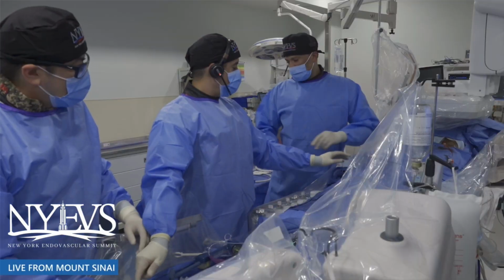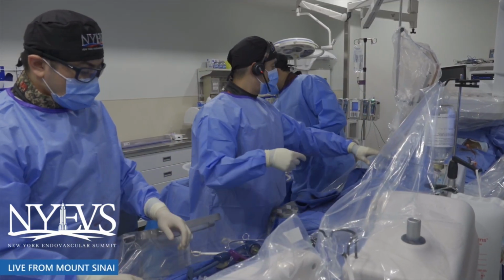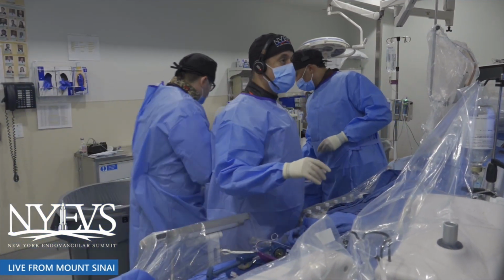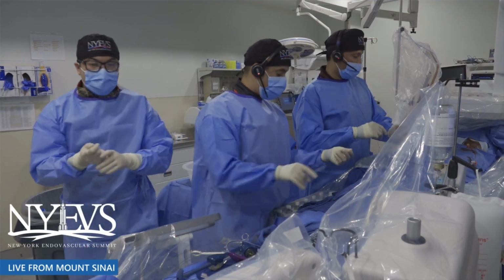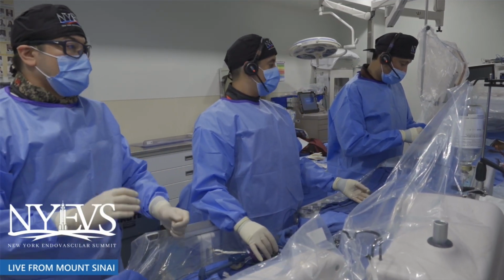Sorry, they're having an issue. So we're going to stay with you. I think the other benefit in this case of going 5 millimeters above is that when you post-dilate, there can be a little bit of foreshortening of these stents, and that could have been the issue in Kingsport where it foreshortened and they were a little short on the proximal end, so that gives you a little bit of an insurance policy against that.